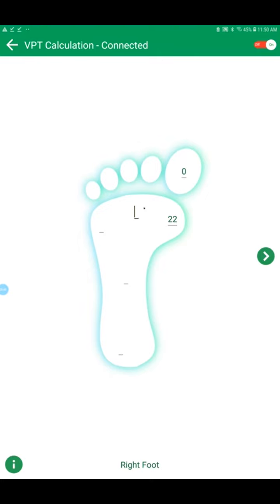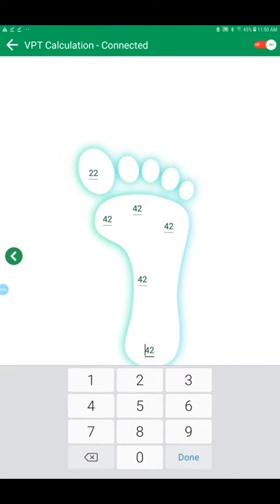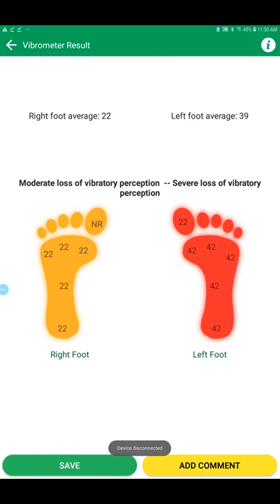So let's assume this value. Okay, this is right. Then on the right toe I am increasing it, testing it. Maybe the patient is getting something at a different value. Okay, so it's done. Then calculating it. Now we can see here you get two different values. For right it is 22, for the left it is 39.